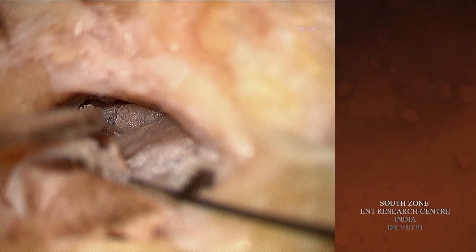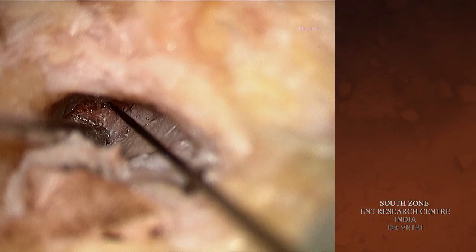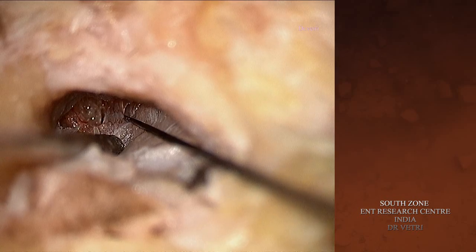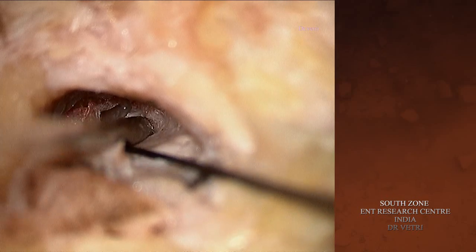And now the mucosa of the middle ear will be opened with an angled pick. This is the anterior part of the mucosa. Anteriorly, the tympanomeatal flap is elevated up to the notch of Rivinus and the anterior malleolar ligament, superior to which there is no annulus.